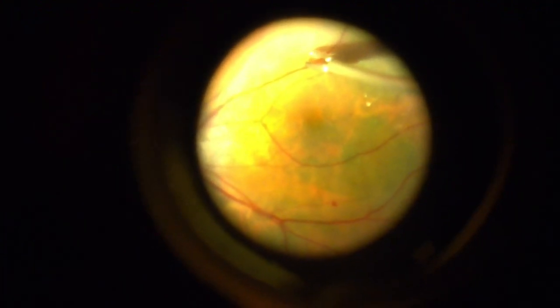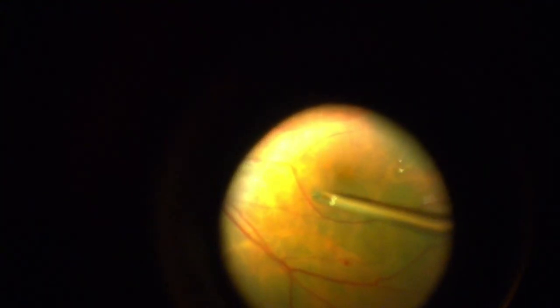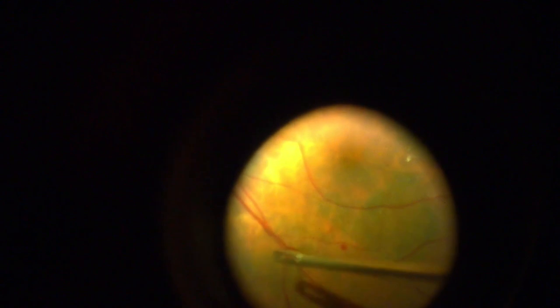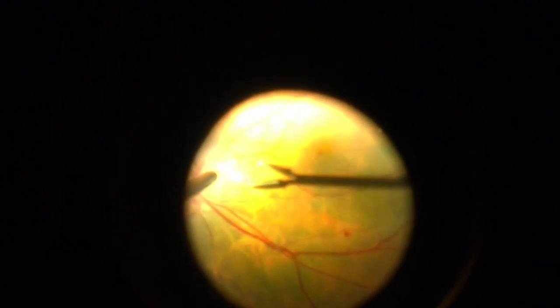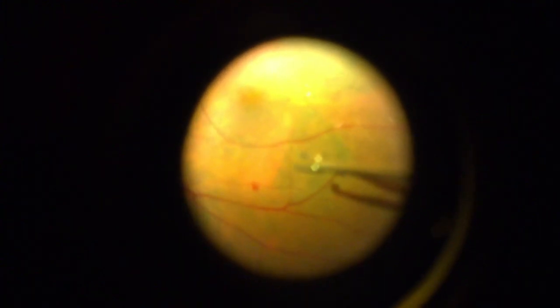So we just grasp these started edges, right? And we peel out, and you can kind of see the ERM coming up first. So the ERM will kind of come off first. The rolling of that is a good sign you got some of the ILM too. Let me focus back down. And of course, you can always go to your other pinch point or start point, which was down here, and do something similar. I don't worry about trying to keep it as one piece, and I tend to knock the pieces off in the eye with the light pipe and then come back later and get all those out.